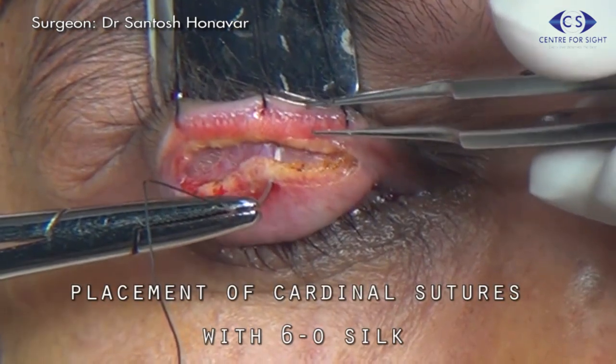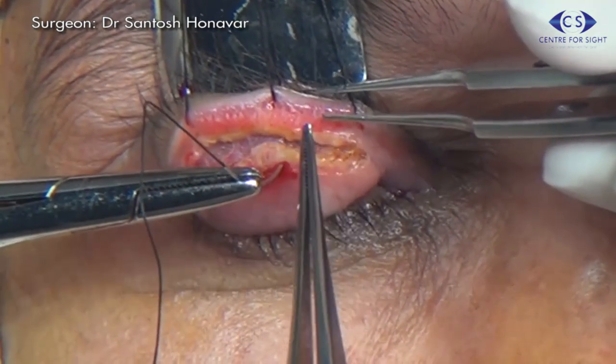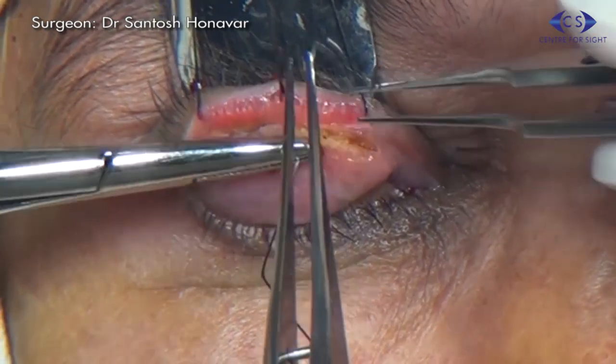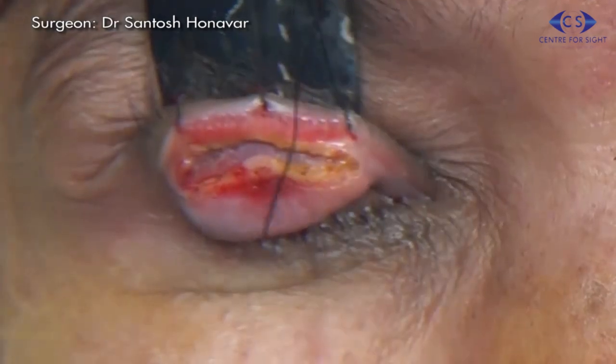The first cardinal suture is taken centrally using 6-0 silk through the distal strip of the tarsus, then under the proximal strip of the tarsus to emerge through the skin just above the lash line.